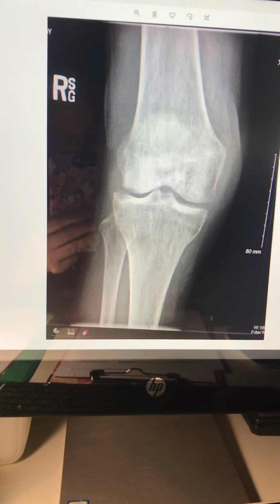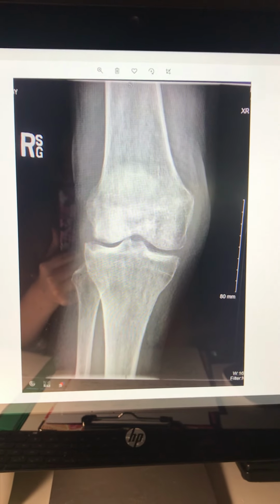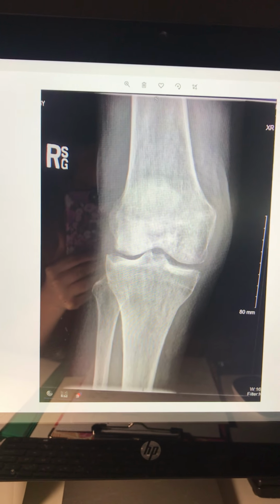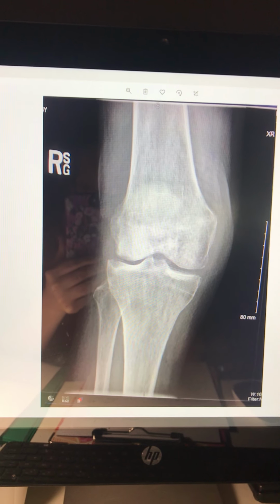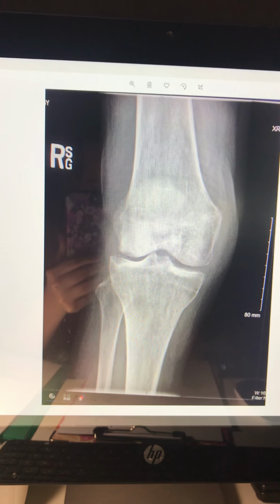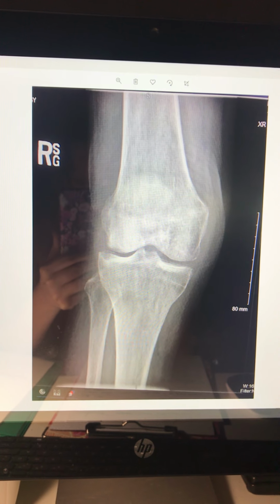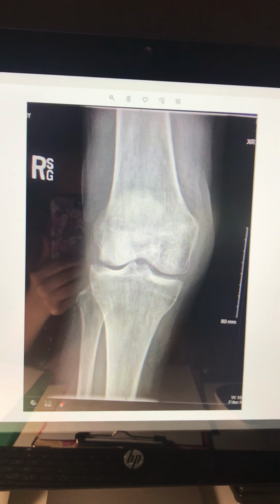Image exposure for this AP: there is proper brightness to see trabecular markings and soft tissues. Bone loss is present. The bone is more radiolucent and it will attenuate the X-ray beam less. The image appears darker. I believe that the technique could have been reduced. The image is still diagnostic quality.